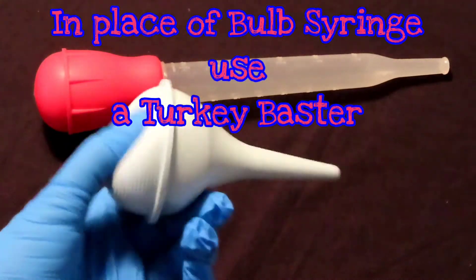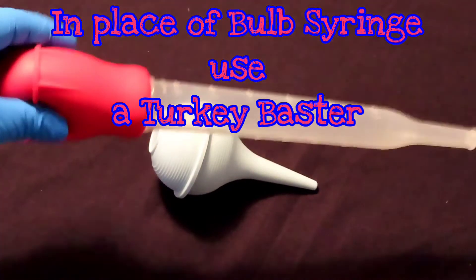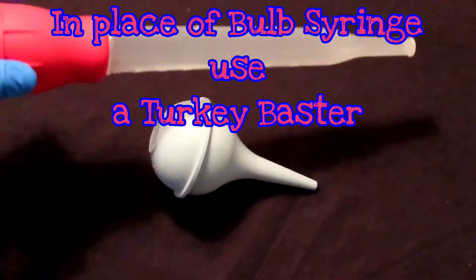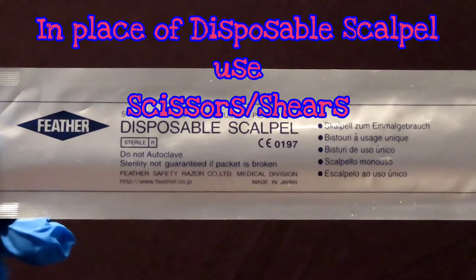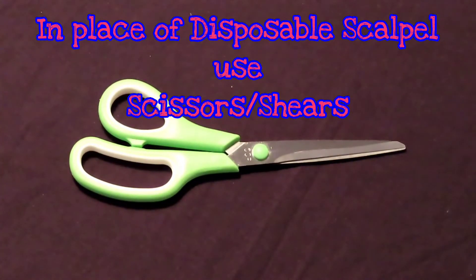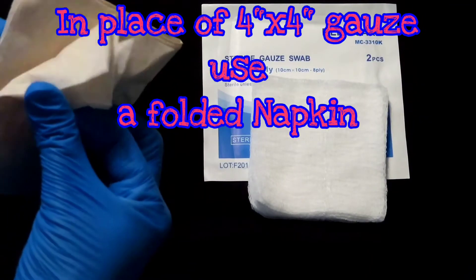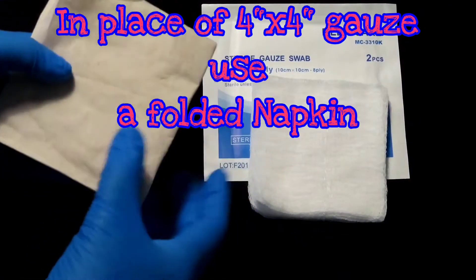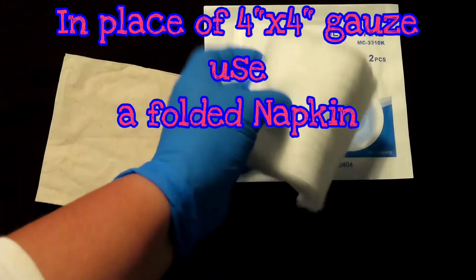You can replace the bulb syringe with a turkey baster. Your disposable scalpel can be replaced by scissors or shears. Here I'm using a restaurant napkin that I just folded in half and I'm using as a 4x4 sterile gauze in lieu of the real thing.